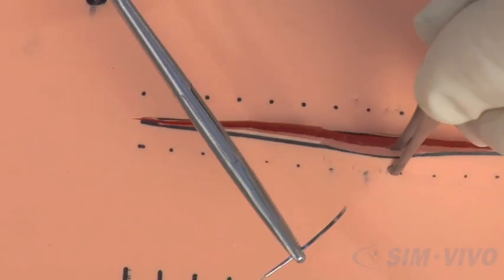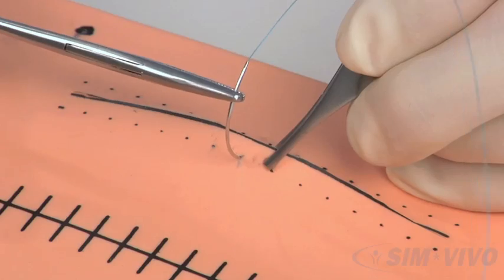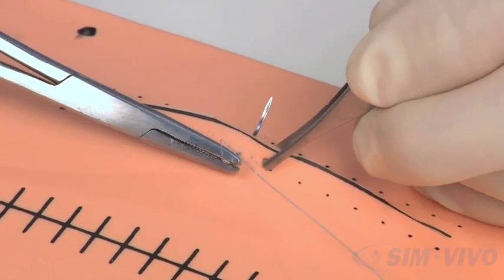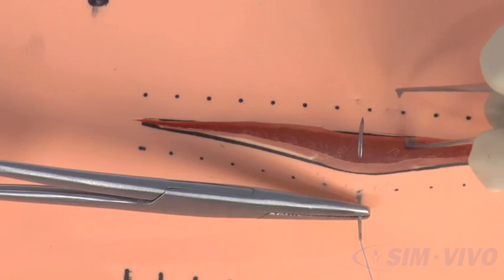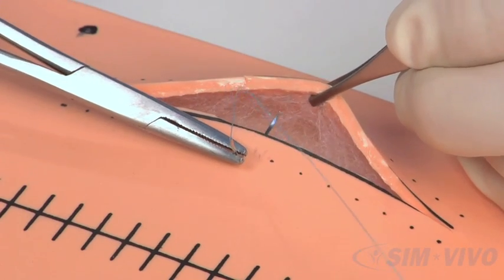Now grasp the part of the skin away from you and hold it up and out. Engage the needle into the skin at a right angle and supinate the needle through the skin. Note that the needle is seen easily in the incision. Then grasp the skin toward you. Engage the skin and come out where the dot is.